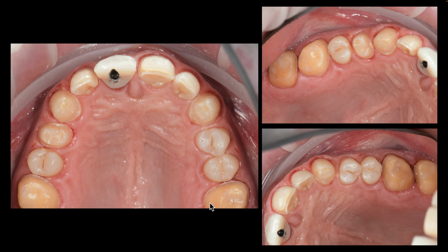And then the molars, we decided to go full coverage, just talking about risk and overall bite force and all of the different concepts to think about, strong tooth, strong restoration, weak kind of preparation, and all of these different concepts we talk about. I did have a discussion with the patient, and we came up with full contour zirconia crowns on the molars for supporting the bite and managing his bite force. But the bicuspids were going to be feldspathic, and we were doing them as conservative as possible. So that's what we came up with. And then conservative veneers on the anterior, except for the implant crown.